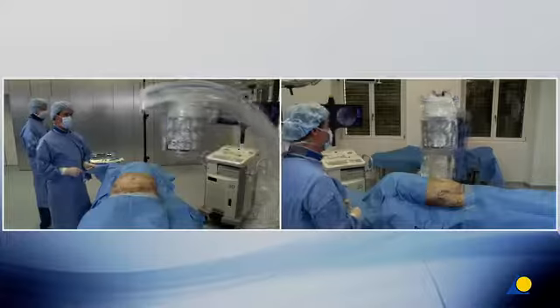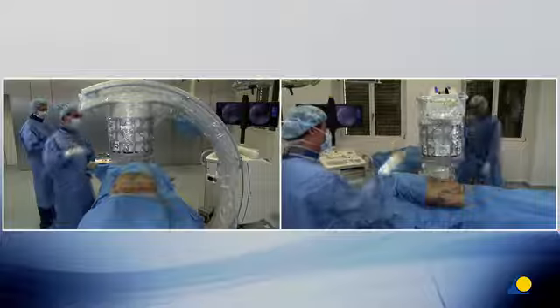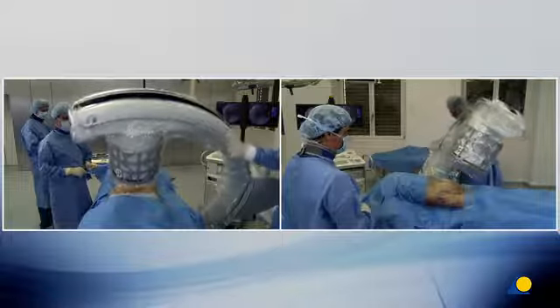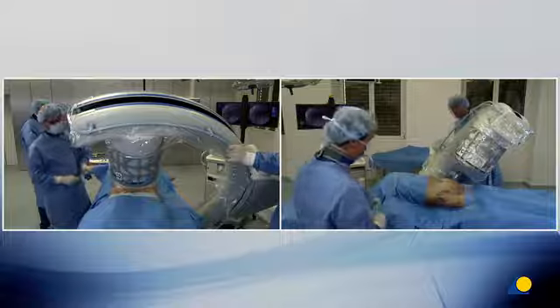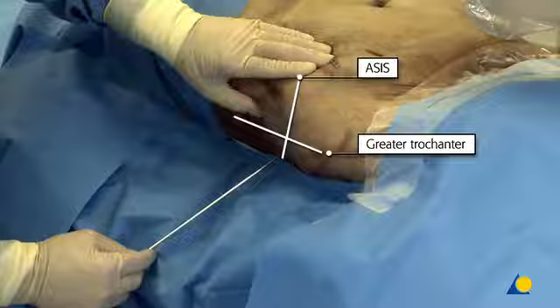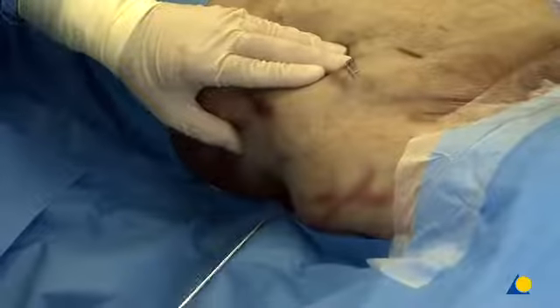The sterile draped C-arm is brought in from the uninjured side and placed in the outlet position. A guide wire with a smooth or threaded tip is used. The preference is up to the surgeon. At the intersection of a line from the greater trochanter proximally and a line dropped from the anterior superior spine, the skin is perforated and the guide wire inserted down to the bone.